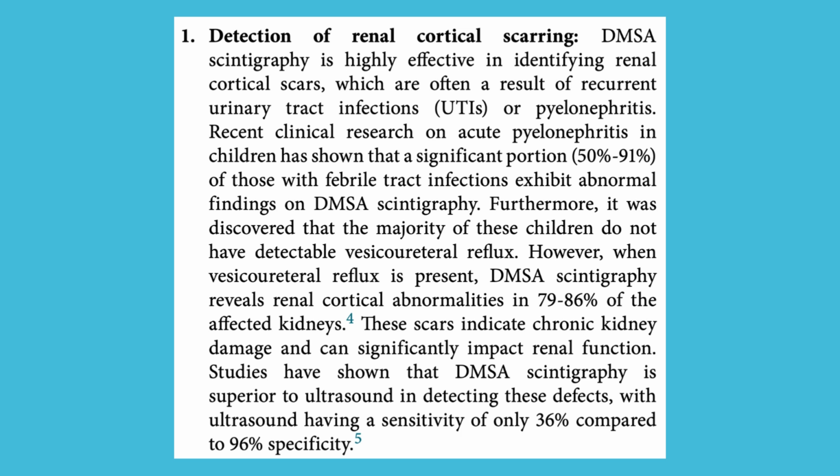DMSA scintigraphy is highly effective in identifying renal cortical scars, which are often a result of recurrent urinary tract infections, UTIs, or pyelonephritis. Recent clinical research on acute pyelonephritis in children has shown that a significant portion, 50% to 91%, of those with febrile urinary tract infections exhibit abnormal findings on DMSA scintigraphy. Furthermore, it was discovered that the majority of these children do not have detectable vesicoureteral reflux. However, when vesicoureteral reflux is present, DMSA scintigraphy reveals renal cortical abnormalities in 79 to 86% of the affected kidneys.